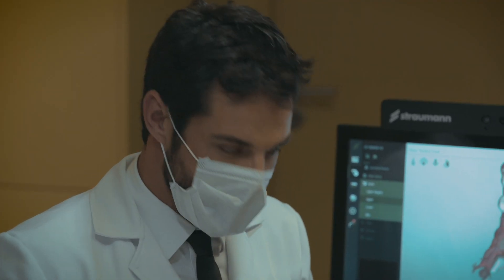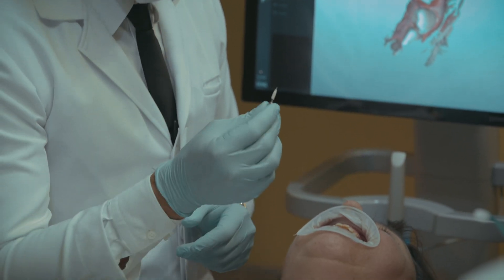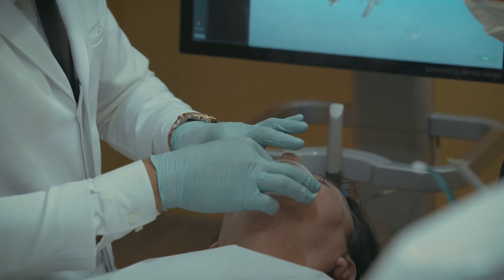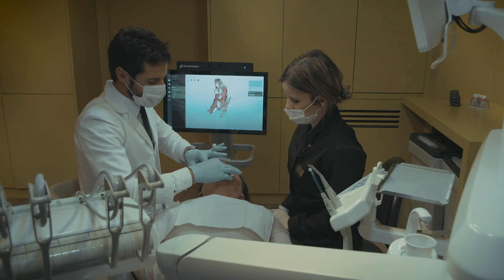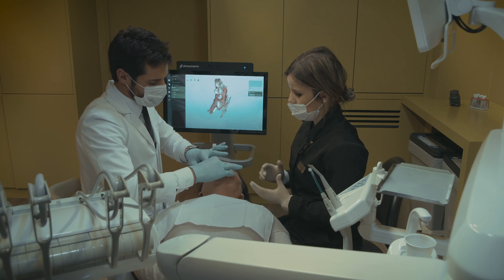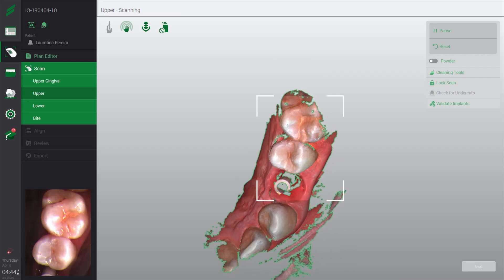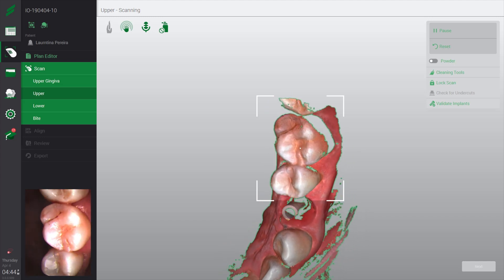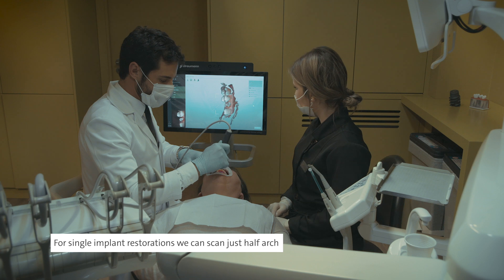Now we will place the scan body in position. The scan body is for our implant — our narrow platform implant, BLT. We always try to orient the flat platform to buccal, to merge the virtual scan body. In this part you detect the scan body and do the full arch scan. In this case we will not do the full arch — we will do a half arch.